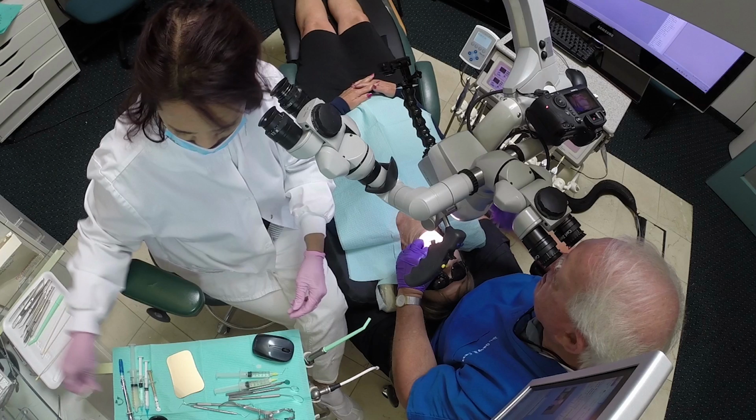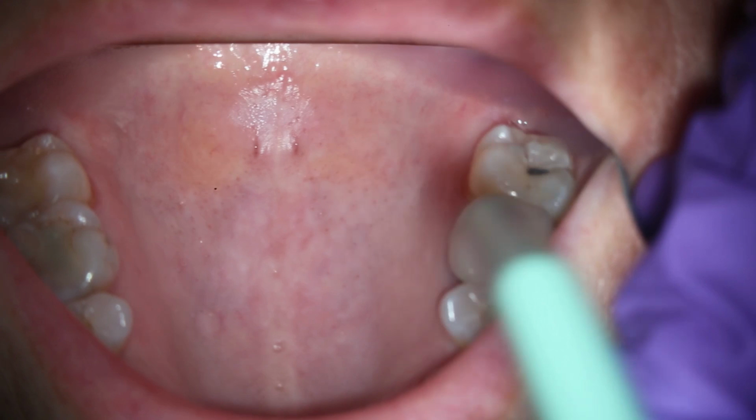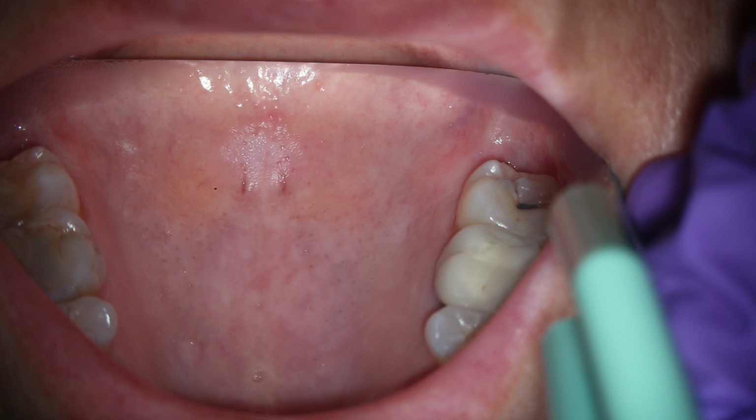And you'll notice some things that maybe you didn't notice in just observing it. The first thing to notice is I'm not focusing by moving the microscope. I'm simply lifting the back of the chair up using my knees and obtaining fine focus that way. Good documentation requires exacting and precise focusing. If you are unable to do this, you will become very frustrated in your photography, and your photography will be inconsistent and take you way too long.